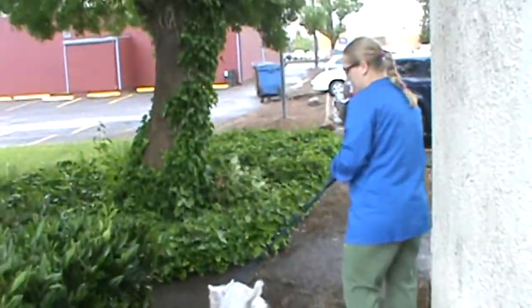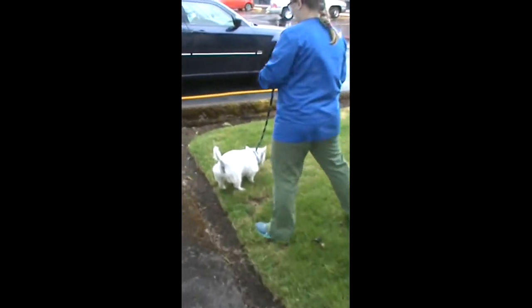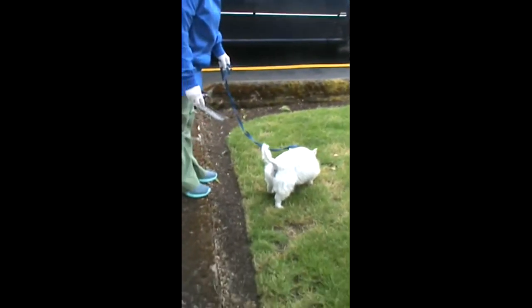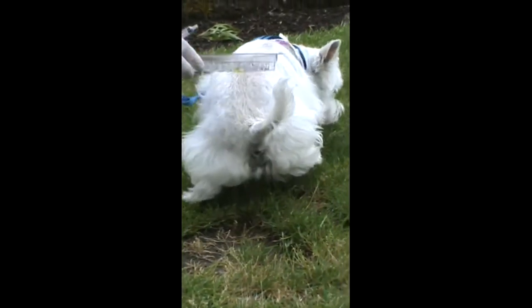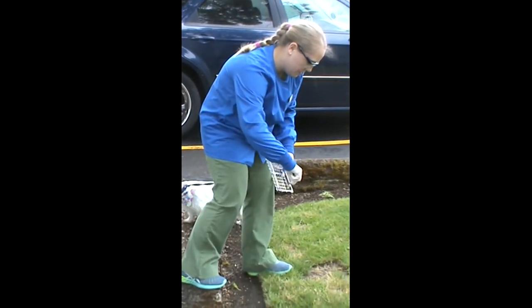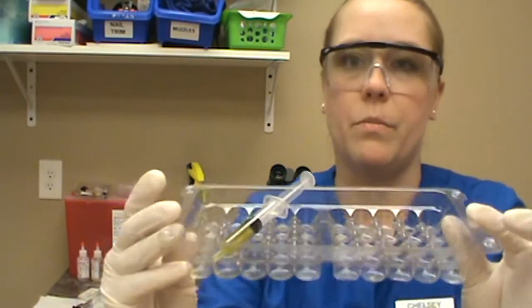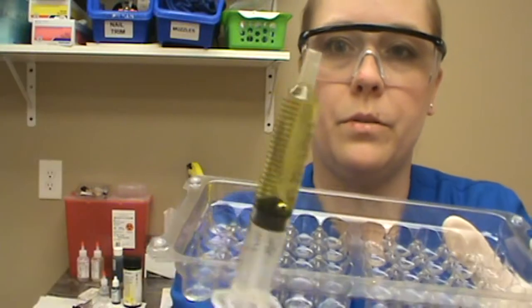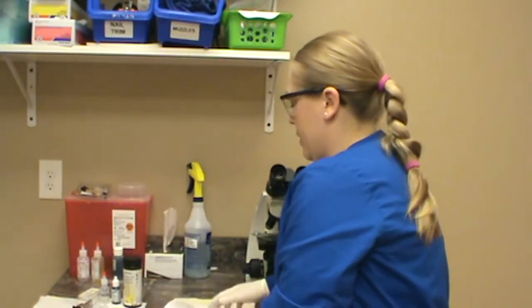Zoom in when we get it. We got our sample — our free catch sample collected a couple moments ago. I'm going to show you that it's two cc's here. You can see the two. So we have that. We have our patient chart, which is for Lucy Southmade.